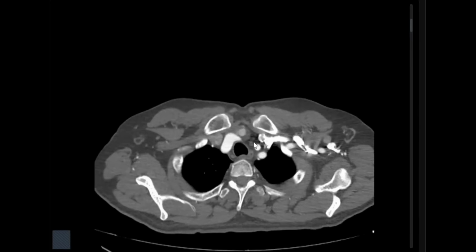So the patient would need an urgent cardiovascular opinion. I will inform the referring clinician about the type A dissection and the associated complications, and urgent cardiovascular review and surgery. So the final management will be surgical.